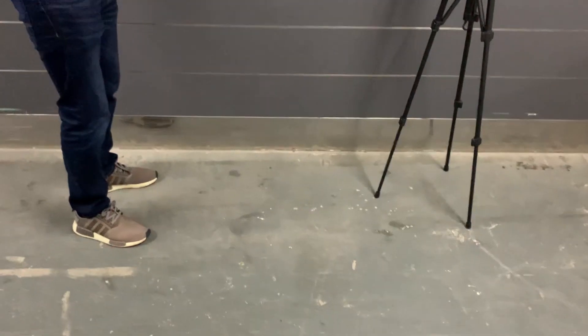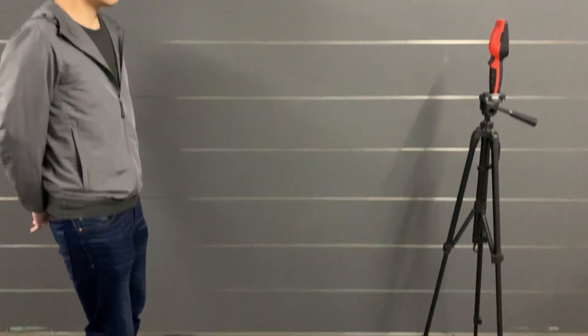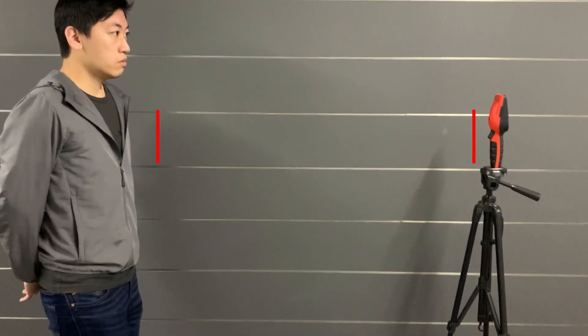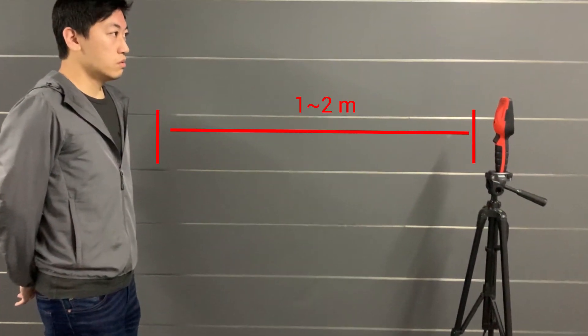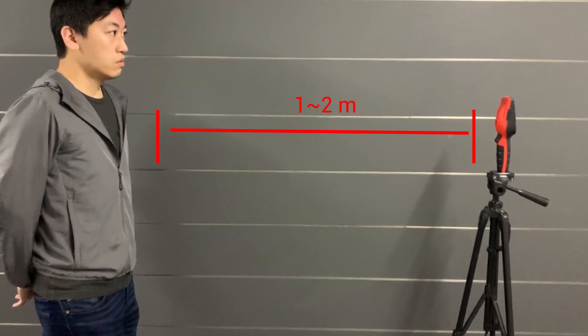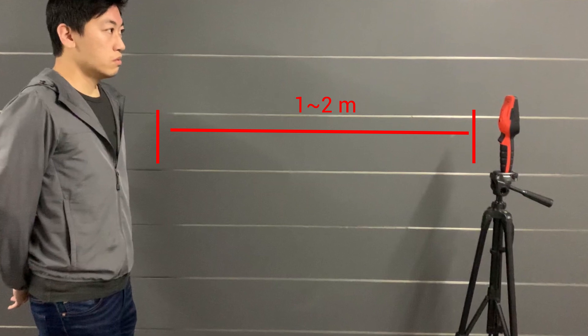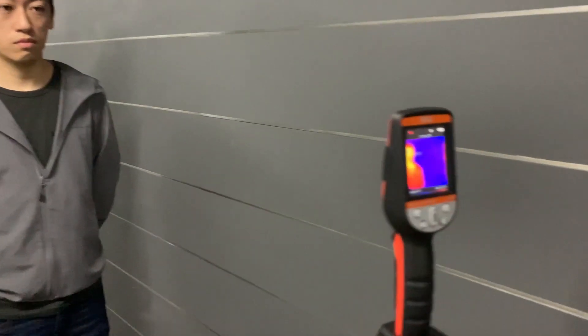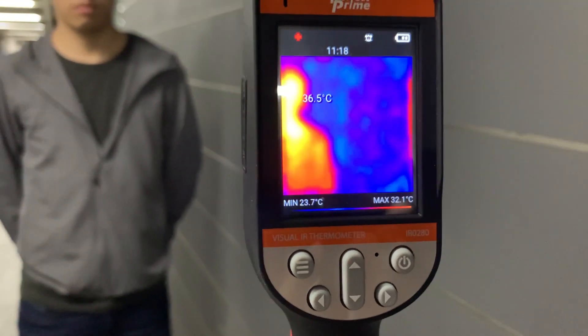An important feature to highlight in the IR0280H is its consistent accuracy at a distance. Typical non-contact laser thermometer needs to be used within 5cm, whereas the IR0280H can be used from as far as 1-2 meters away.